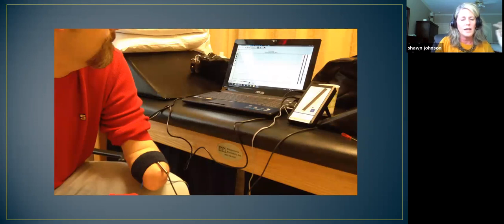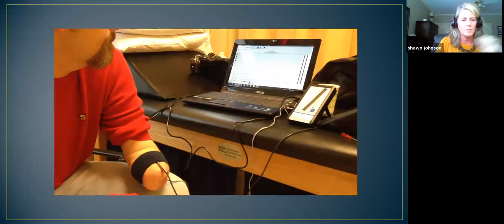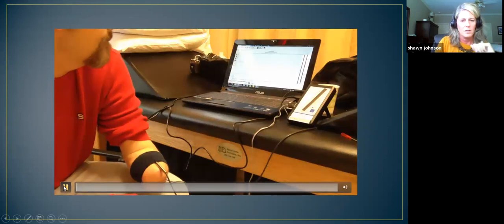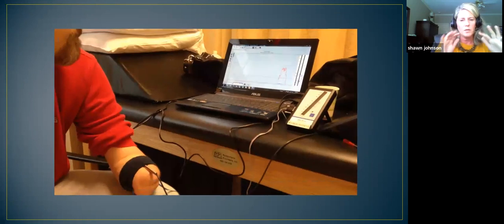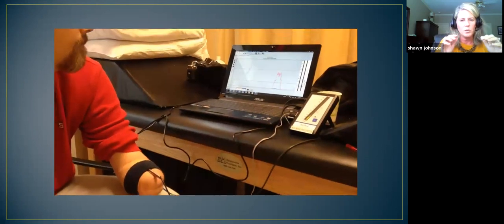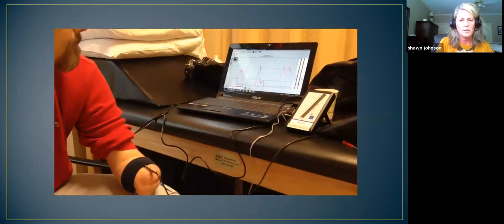Okay, so here are some videos. Please raise hands or wave or someone yell at me if you cannot see them for whatever reason. Let's see. Myo Soft, old school, showing his open signal and a closed signal.